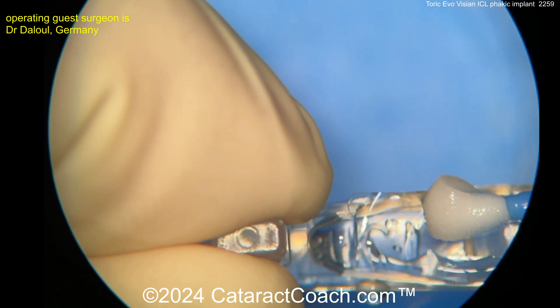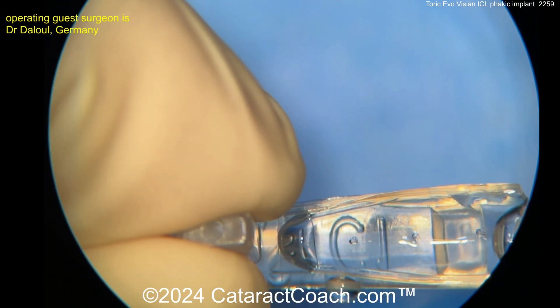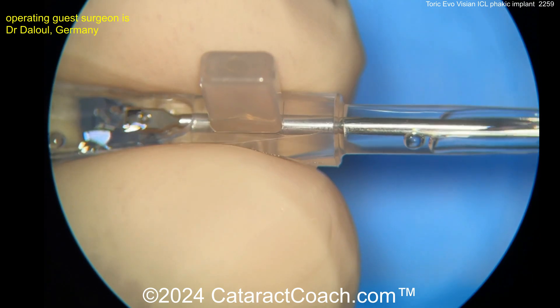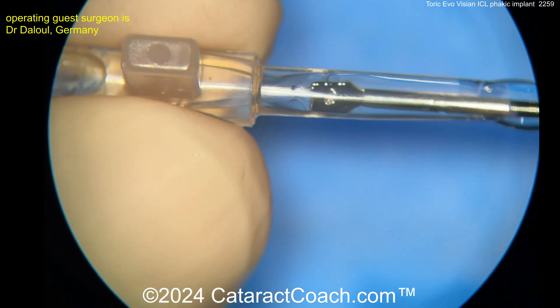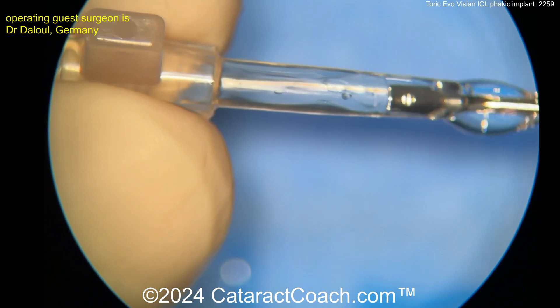The lens has these four footplates, and it's placed into the injector. Special forceps are used to actually pull the lens into the injector — the forceps go into the tip, go inside, grab it, and pull. You just can't push it because it's too thin and flexible; it'll actually distort.